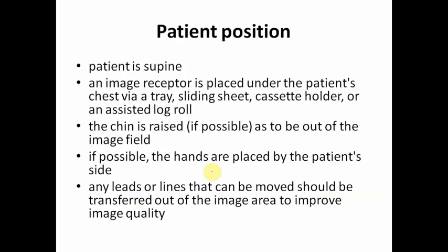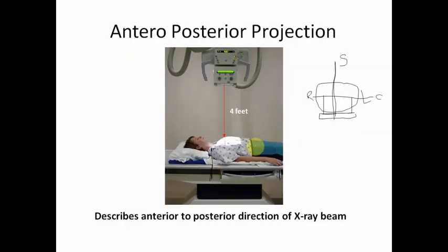At the same time, the lower part you can see here is the lead apron, lead cover. The lower part of the abdomen should be covered, because sometimes the primary rays will come here, and sometimes some of the scattered low primary rays also might reach this, because X-rays from the X-ray tube always come in a fan shape. So here you can also see it is well collimated, so as to make an exposure of only this much area. Avoid unnecessary exposure to this; you should collimate.